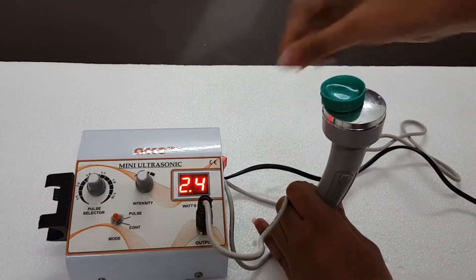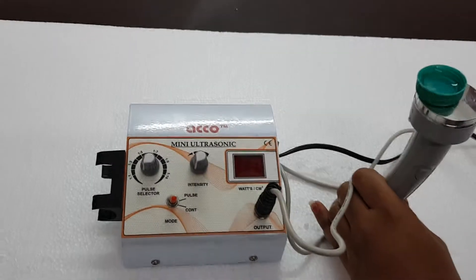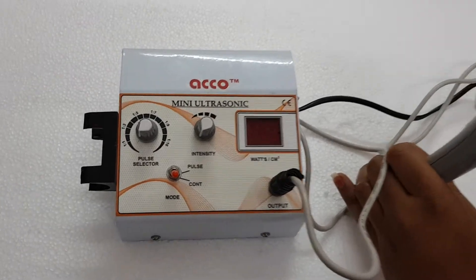After treatment is completed, make the intensity knob at 0 and switch off the machine. The demo is completed. Thank you.